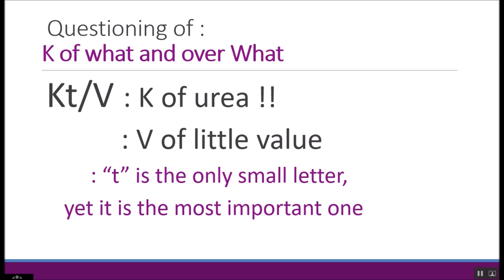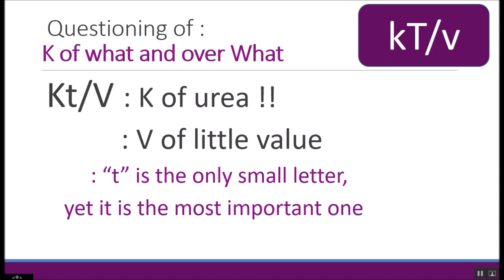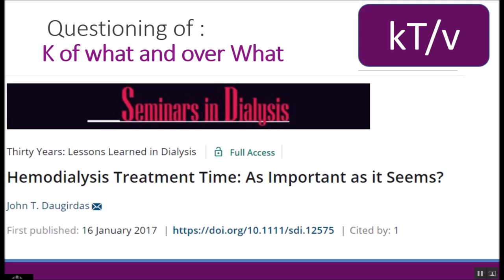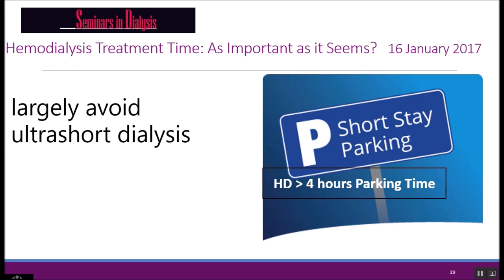We have to stress the time of the dialysis session, the length of the dialysis session. So it should be like that. Increasing the time is the most important one. Keeping your patients on a long dialysis session is the most important factor in the adequacy of hemodialysis. Don't go for shorter dialysis sessions with very fast blood flow and a bigger dialyzer, because you will find a huge rebound after that. At least 4 hours is required for each dialysis session.